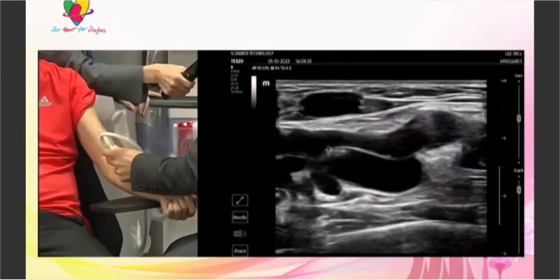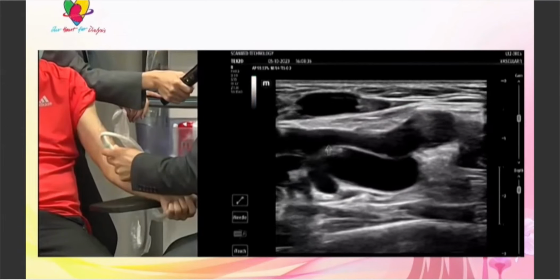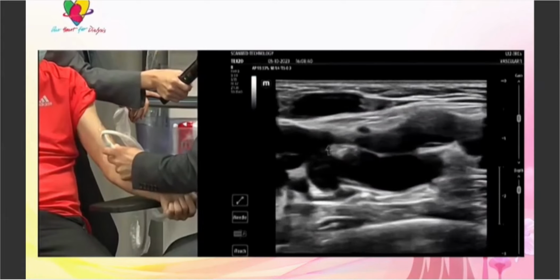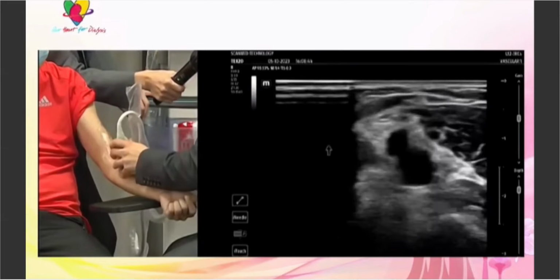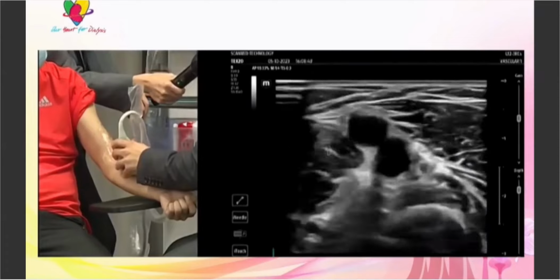Yeah, so I would measure the diameter here to see, but I wouldn't treat it because it's completely asymptomatic, unless he has problems with dialysis. And the flow is so good that I wouldn't treat this even if it is 3.2 millimeters or 2.8 millimeters. Let's go back to the transverse to make it a little bit easier.